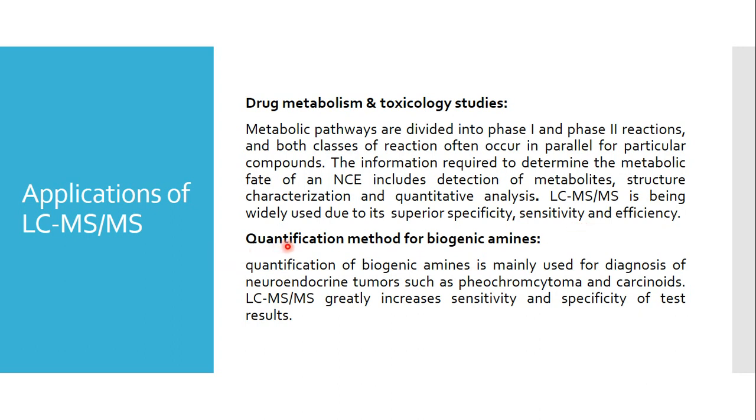The next application is the quantification method for biogenic amines. Quantification of biogenic amines is mainly used for diagnosis of neuroendocrine tumors. Many of the hormones, or you can say neurotransmitters, in our body are chemically amines.